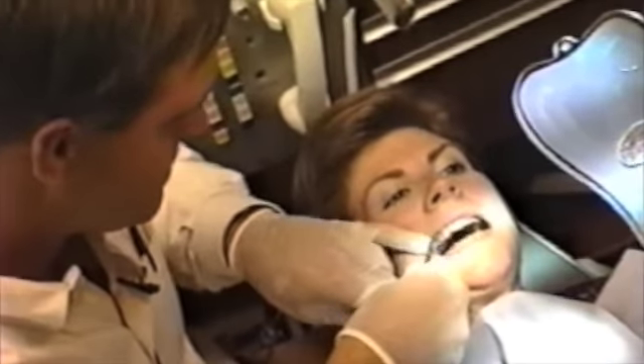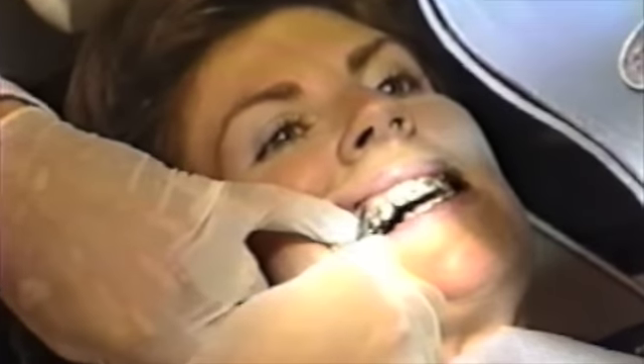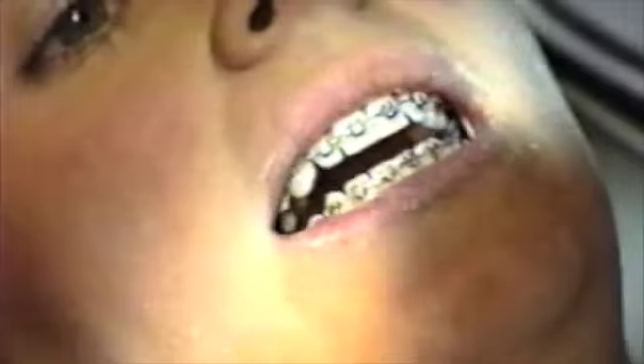This is the same patient seen after cuspid retraction, realignment of the anterior and posterior segments, and retraction of the incisors. The lateral incisor teeth were malformed at the start of treatment. The lingual cusp had to be removed under local anesthesia. Porcelain crowns will be placed after debanding. The finishing of this case took significant effort with many second-order bends required.